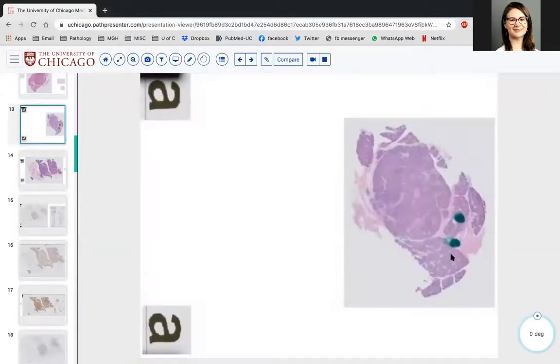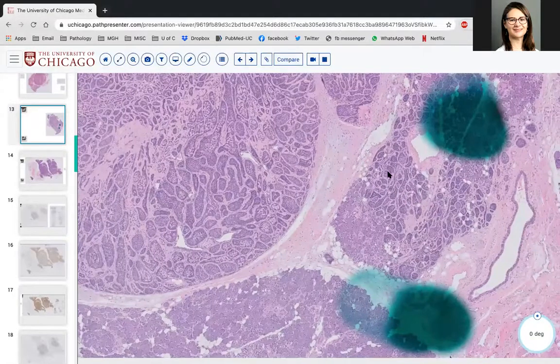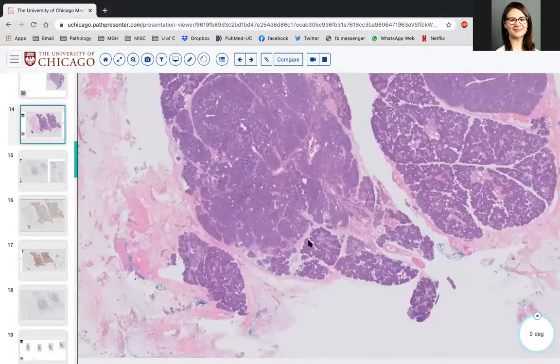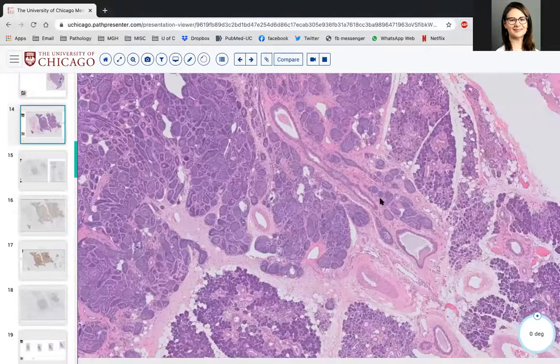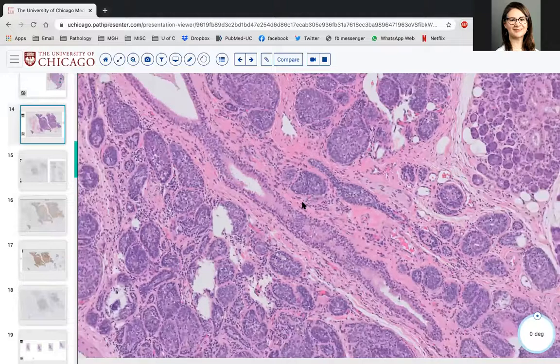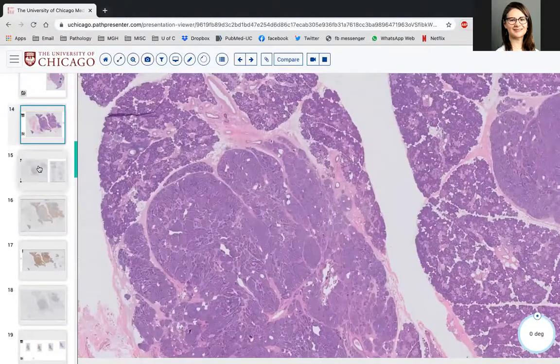And here's the permanent section remnant of the frozen, again showing this nice dotted island of infiltration between the normal parotid tissue. And here's the permanent section that again confirms this lobulated invasive growth. Oh, this is lovely. It's tracking along either side of this totally benign duct in the middle, right? So the tumor on top and bottom of the benign duct. So interestingly, does anybody want to see stains? I've got some. If so, what do you want to see?